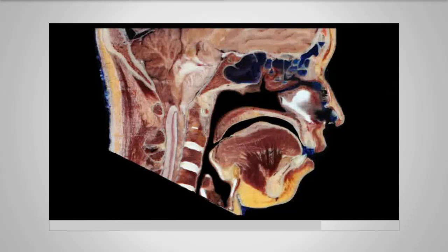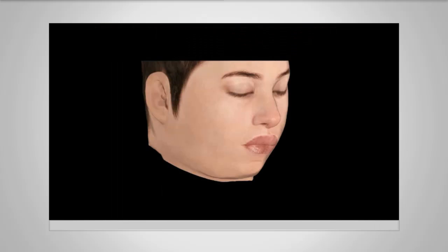Okay, so just real quickly, you can see how teeth are basically the anterior border of the tongue. And so where that tongue lives is totally dependent on the size of the oral vaults and the anterior position of the boundaries, which are essentially the anterior teeth. And so anterior teeth position come into play in orthodontics, because we're always talking about angulation of incisors, position of the mandible, and so remember that huge organ known as the tongue is attached to the inferior border of the mandible.